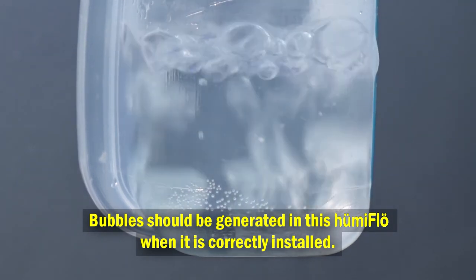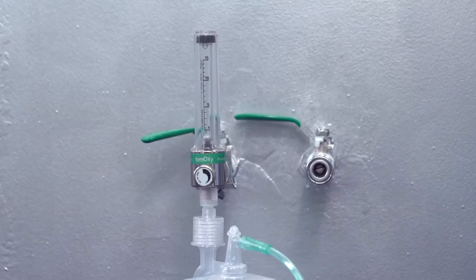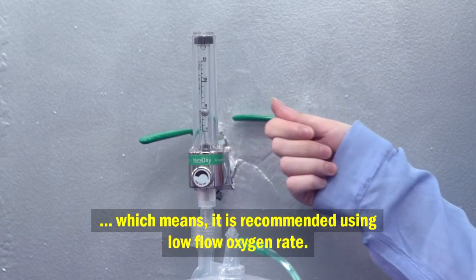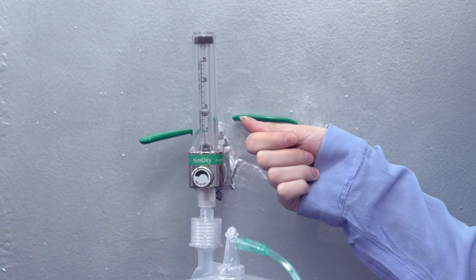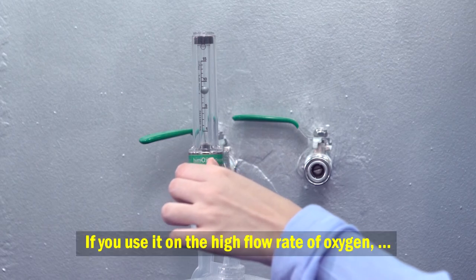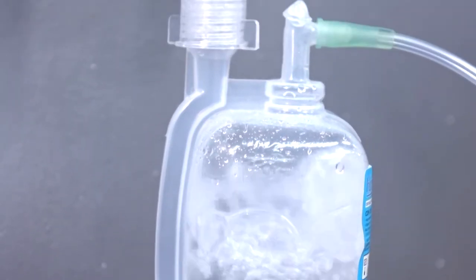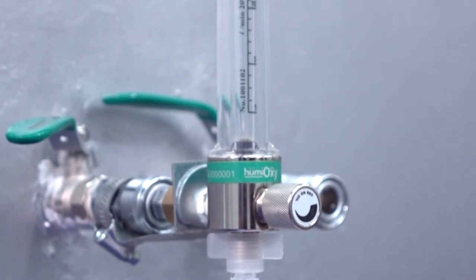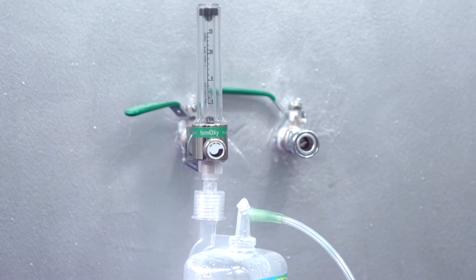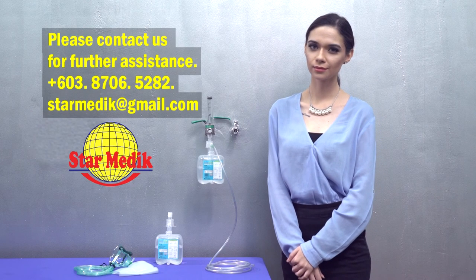Bubbles should be generated in Humiflow when it is correctly installed. Humiflow is intended for low flow oxygen therapy, so it is recommended to use a low flow oxygen rate. If used at a high flow rate, you will hear the sound of leaking or whistling — this is for security purposes. Thank you for choosing Humiflow. Please contact us for further assistance.